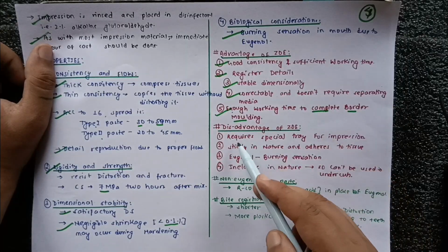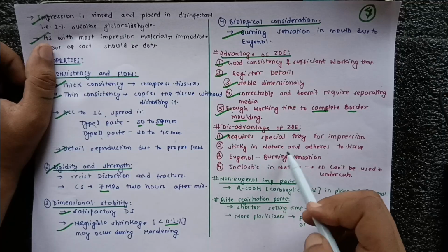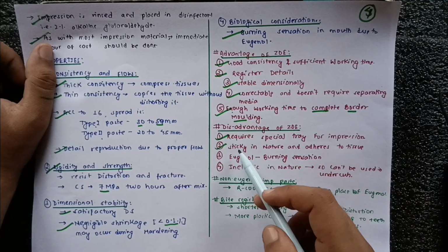And the disadvantages: it requires a special tray for the impression, which is a custom tray. Another, it is sticky in nature and adheres to the tissue, so it may cause problems sometimes. It is quite sticky.